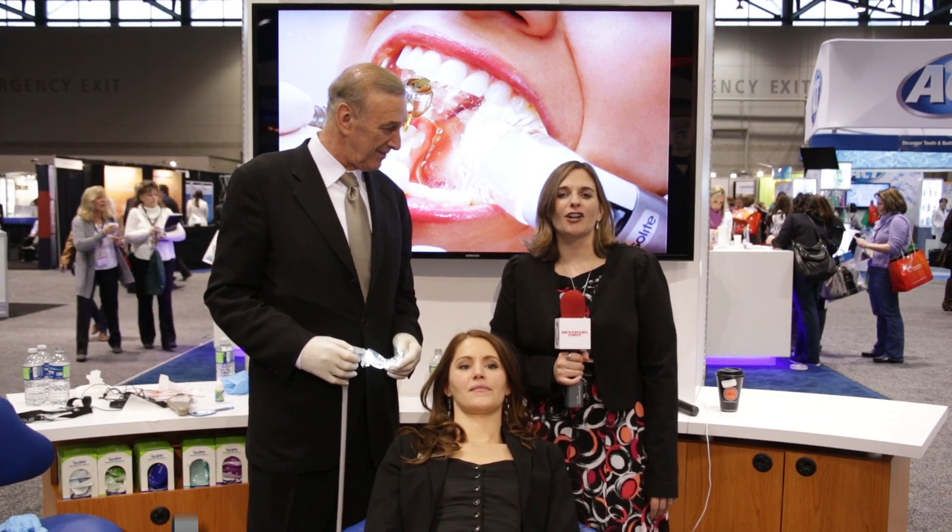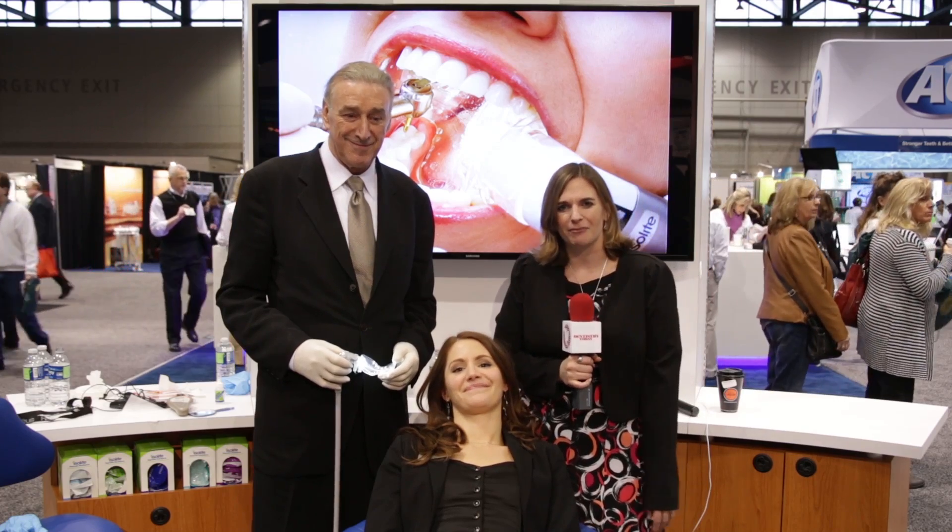Hi, I'm Allie Cook for Dentistry Today, coming to you from the floor of the Chicago Midwinter Meeting. Right now I'm at the Isolite Systems booth where I'm joined by Dr. Thomas Hirsch, who is founder and director of clinical affairs at Isolite Systems, and our volunteer Tara, who's going to help out with the demonstration today.